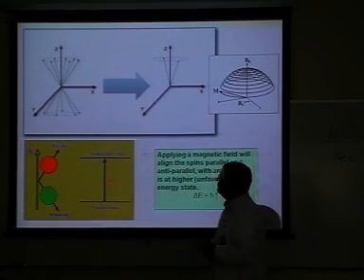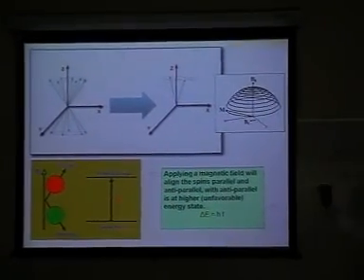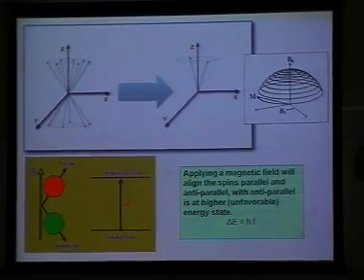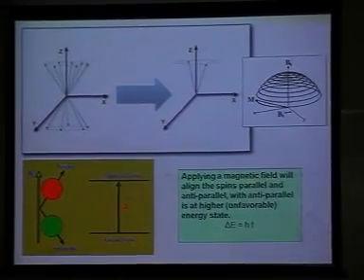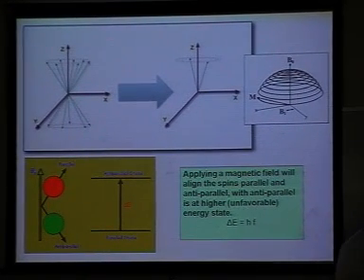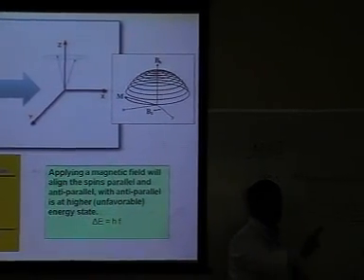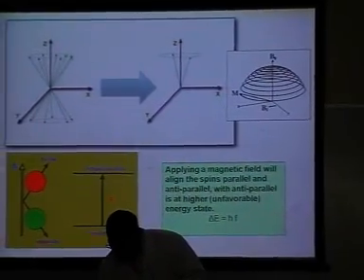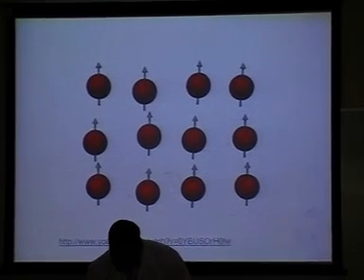If you notice here, at the beginning I have a net magnetization that is along Z, and as I apply an RF signal, I'm going to get more of the X. If I call this Z, and this is my XY plane, then I will have an MXY, a magnetization that will develop in the XY plane, the transverse plane, perpendicular to the initial one. We need to say a little bit more about this.